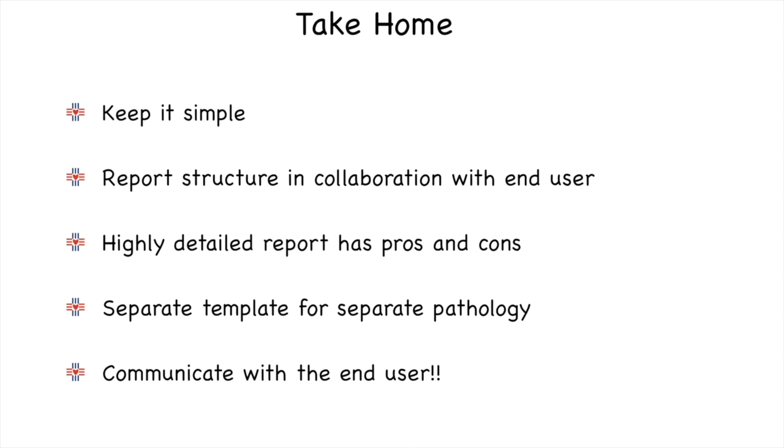To conclude, my message for any cardiac MR report is to keep it simple. The longer the report becomes and the more details that we provide, it becomes very difficult for the clinician to go through the report and understand it clearly. Report structure has to be built in collaboration with the end user. A separate template for separate pathology is useful, so the clinician understands where to look for specific information.